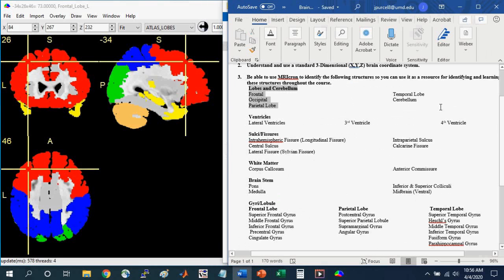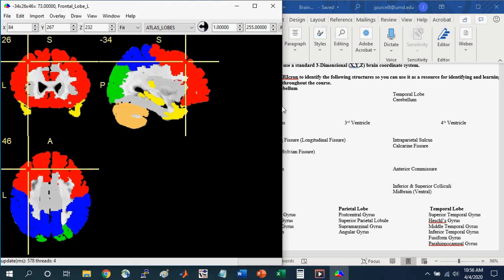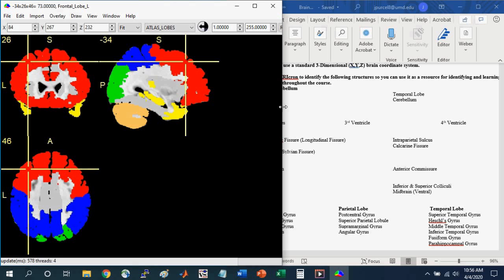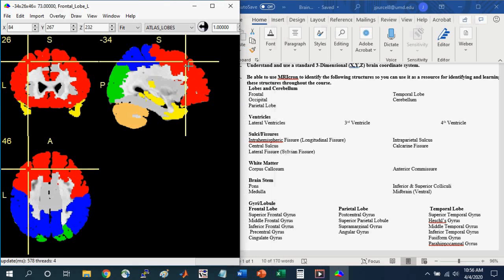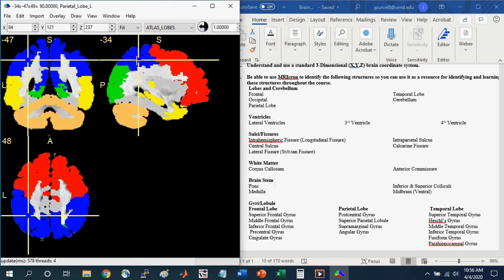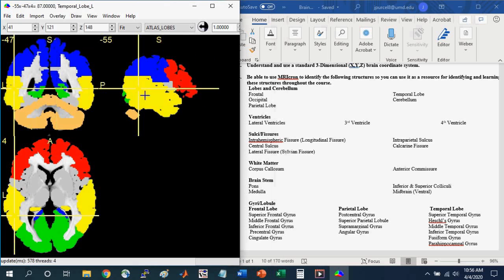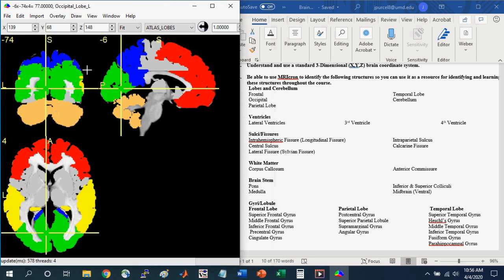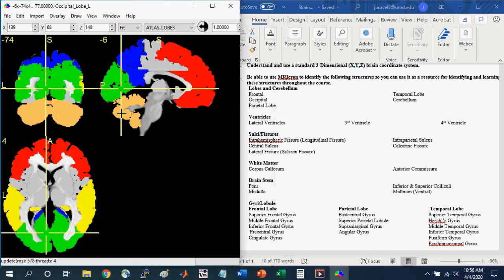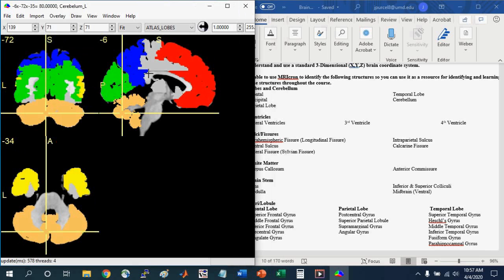And so up here at the top, you see that we focused on the lobes and the cerebellum. And so here in the MRI-Cron window, you can see just by clicking on the colored regions, you can identify these different structures. So clicking on the red, you can identify the frontal lobe. Clicking on the blue, you can identify the parietal lobe. Clicking on the yellow, you can identify the temporal lobe. And clicking on the green, you can identify the occipital lobe. And finally clicking here on the tan, you can identify the cerebellum. And just by clicking around and navigating through the brain in this manner, you can learn how these different structures relate to each other.